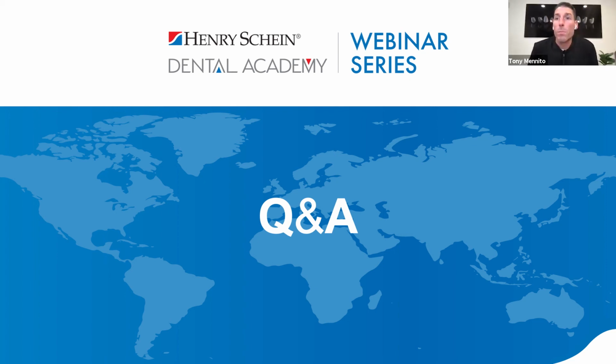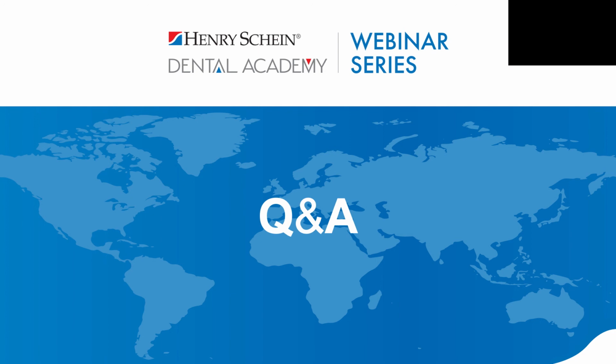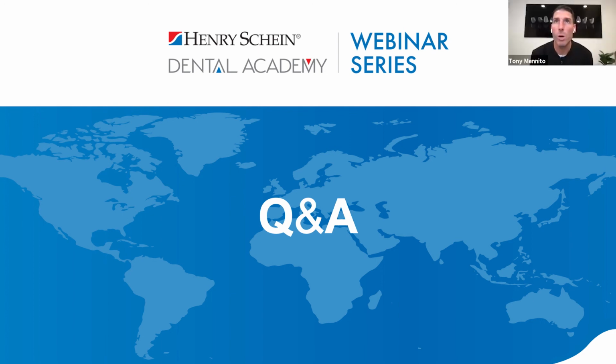That is a good question. So like I said, in general, you have to kind of look at the material. Most of these materials have been categorized as hybrid materials, meaning there is some ceramic or glass content in them. So I think across the board, for the most part, and you need to verify this with whatever material you're using, those are coded out as ceramic restorations. For me, most of the time that I do those composites, I am going the other way. I'm billing them as direct composites rather than as ceramic options.